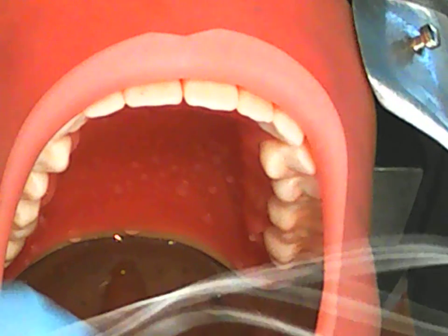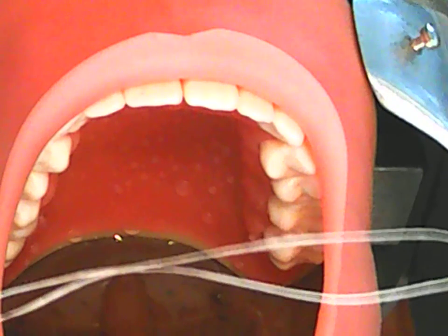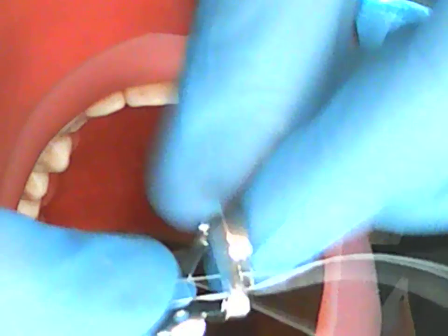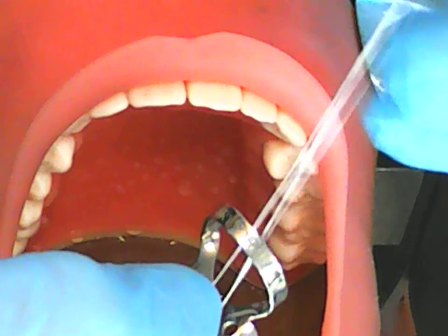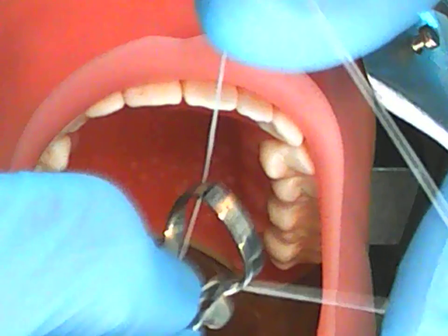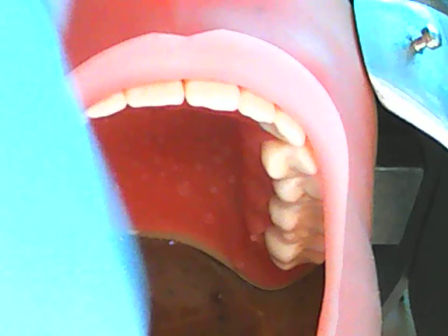The first thing I'm going to do is get a piece of floss and double it up. Okay, once I've doubled it, I will lay it over my tray. Of course, I would work on the tray, but for the sake of the video I'm doing it in front of the screen. The floss goes behind the bow. Get your fingers kind of through your floss like this. Okay, underneath. There we go. Retrieve the tail end.